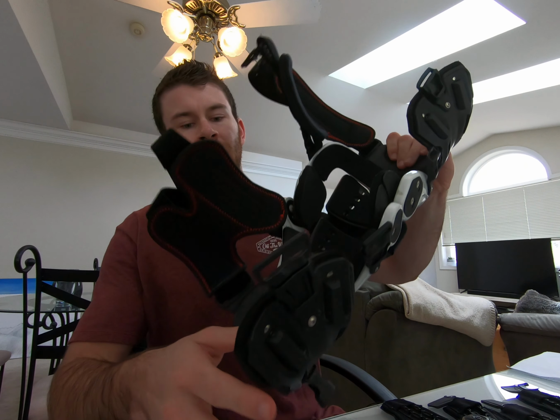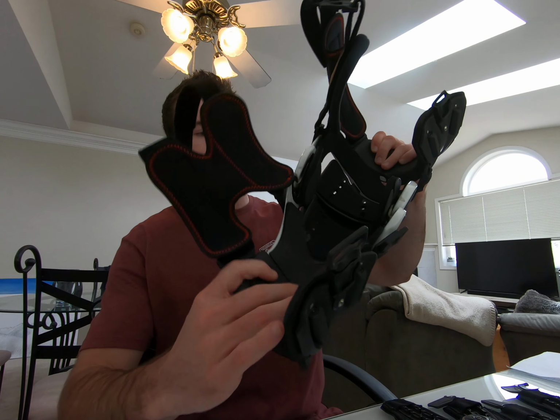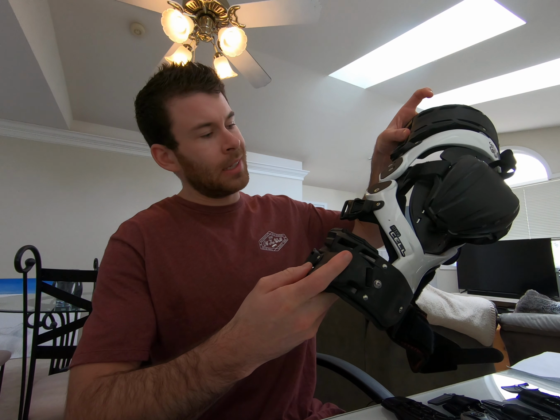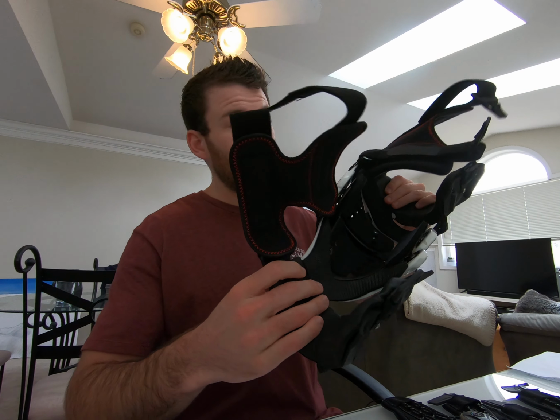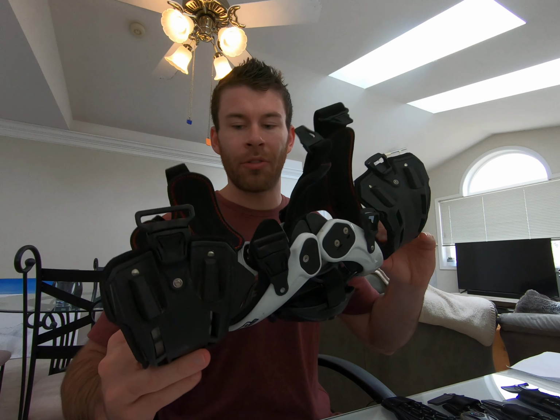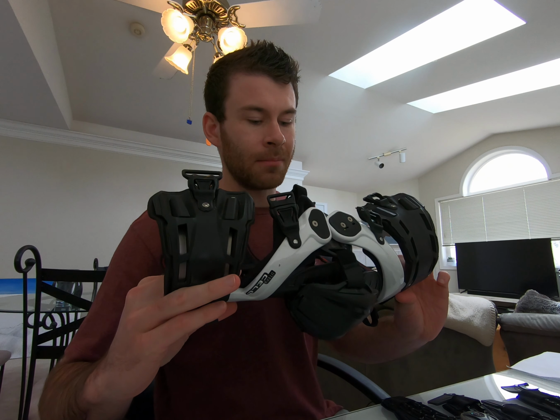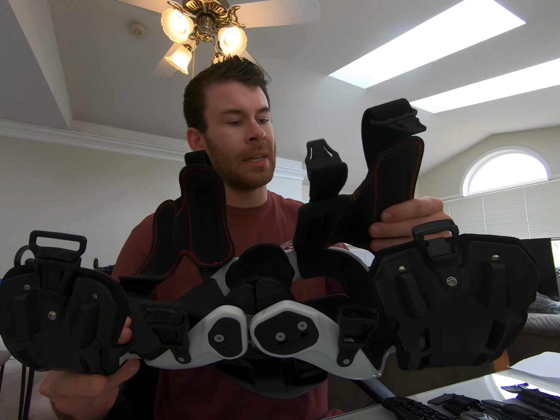But what I highly recommend when you're checking out knee braces is truly get a feel for what you want on the back of them. The front of the knee braces, all of them are not that far different. They all fit, they're all not that comfortable, but what makes a huge difference to me is just the bloody straps. The straps either feel great and light and make the whole thing feel slimming, or they feel large, cumbersome. So I highly recommend, if you get the opportunity, go try a few on in the store.